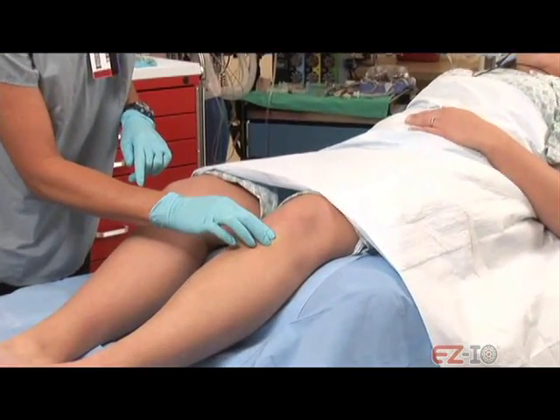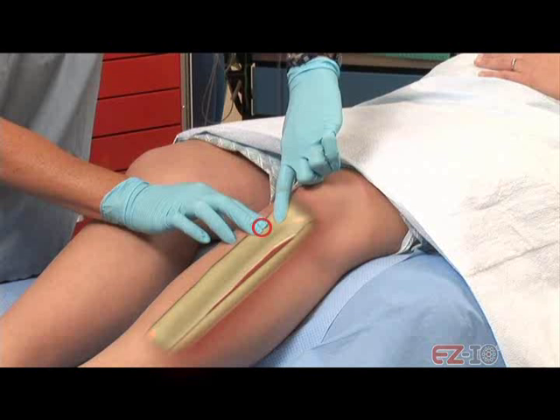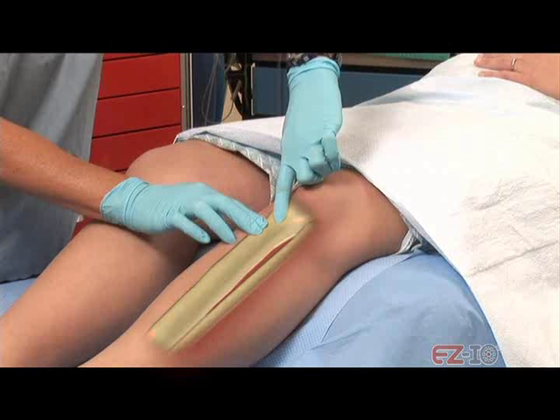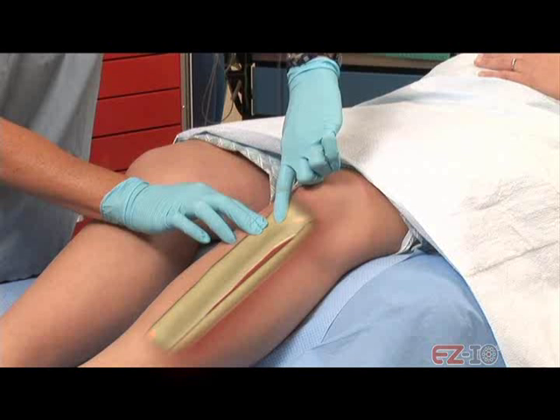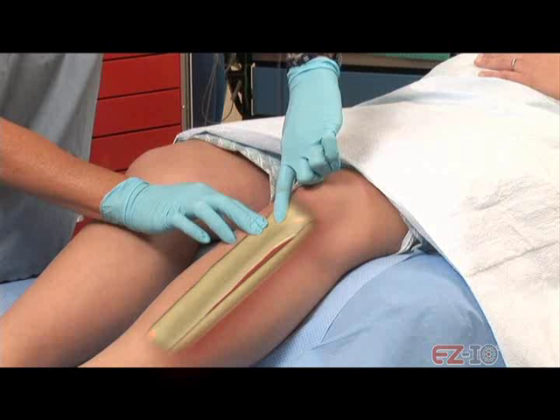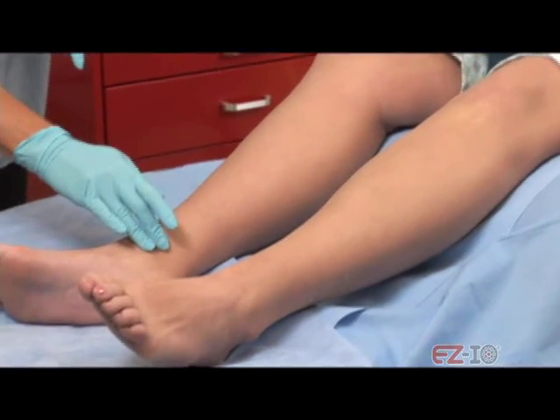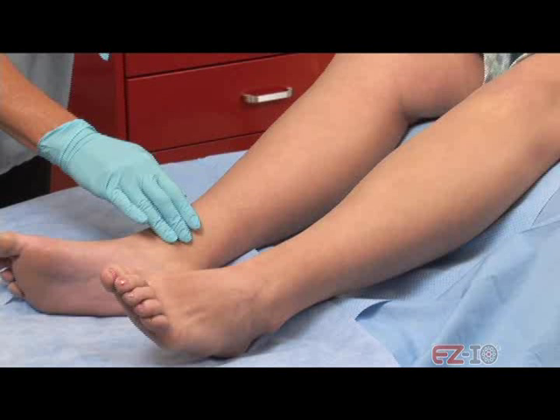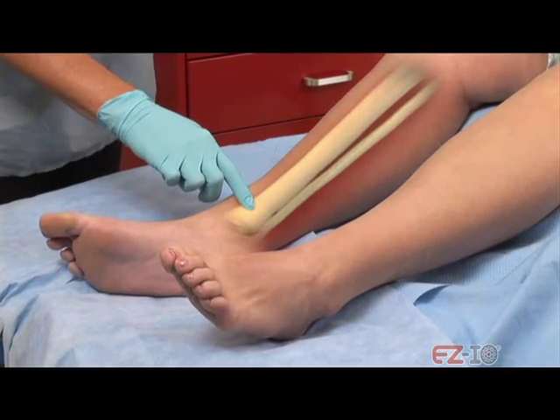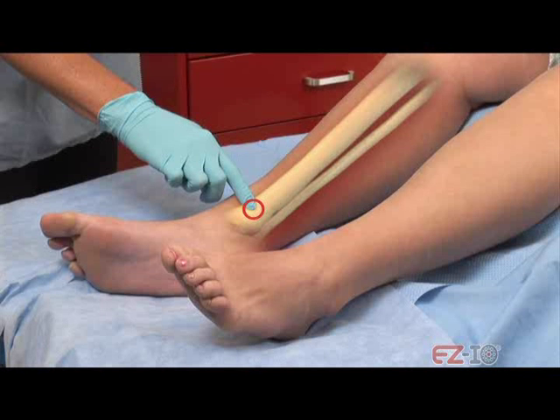Approximately 1 centimeter above the surgical neck is the insertion site. VitaCare recommends the 45-millimeter needle on patients weighing more than 40 kilograms. The humerus is the preferred site for patients who are responsive to pain. Once insertion is completed, secure the arm in place to prevent movement and accidental dislodgement of the IO catheter. The proximal tibia insertion site is approximately 2 centimeters below the patella and approximately 2 centimeters medial to the tibial tuberosity depending on patient anatomy. The insertion sites for pediatric patients are the same as for adults. In small children generally under the age of 2, the tibial tuberosity may be difficult or impossible to locate. If it cannot be palpated, locate the distal aspect of the patella, move approximately 2 centimeters distally, then medial to the flat aspect of the tibia. The distal tibia insertion site is located approximately 3 centimeters proximal to the most prominent aspect of the medial malleolus. Place one finger directly over the medial malleolus, move approximately 3 centimeters proximally, and palpate the anterior and posterior borders of the tibia to ensure the targeted insertion site is on the flat center aspect of the bone.